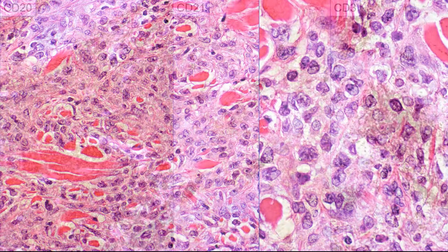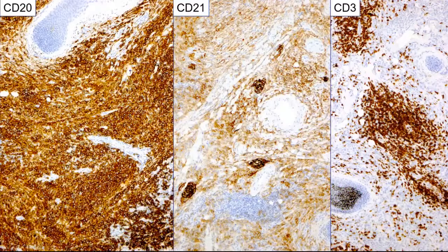And when we immunophenotype this, we see that the atypical cells are CD20 positive. So we're on pretty firm ground saying that this is a B-cell lymphoma. When we look with the follicular dendritic cell marker CD21, it does turn out that there are some little follicular dendritic cell meshworks within the lymphoma. And then there's also a decent component of small T cells highlighted here with CD3.